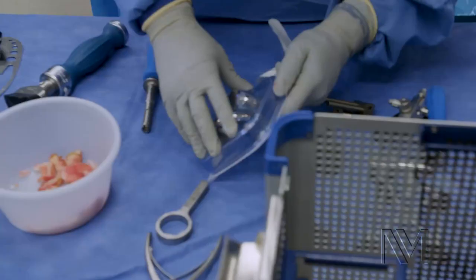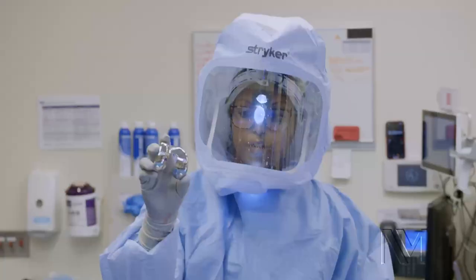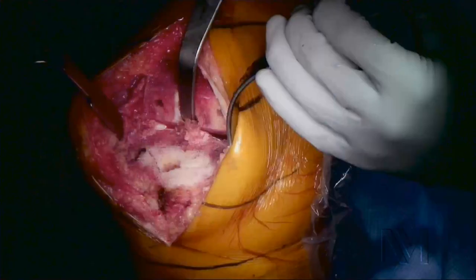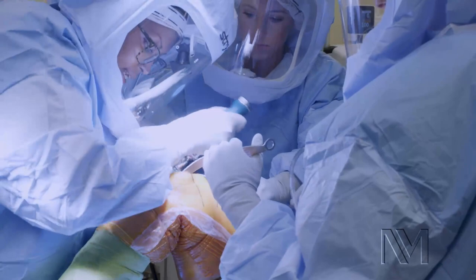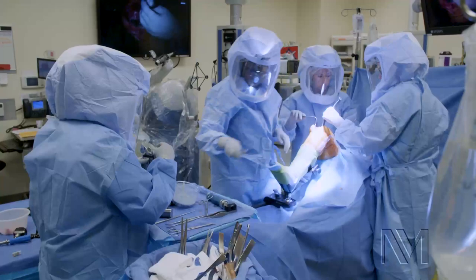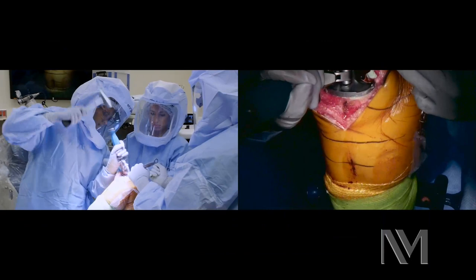Now we put the real deal in. This is our femoral implant. This is our tibial implant. I take some cement and put it onto the tibia on the bone itself. We're now taking the implant and cementing it in. We're now going to put the femur on.